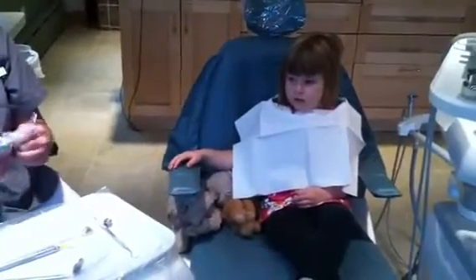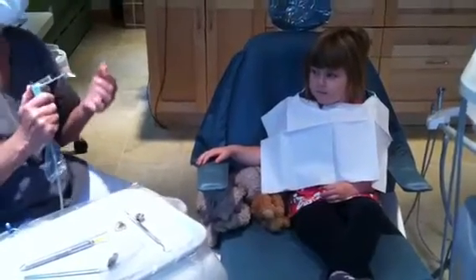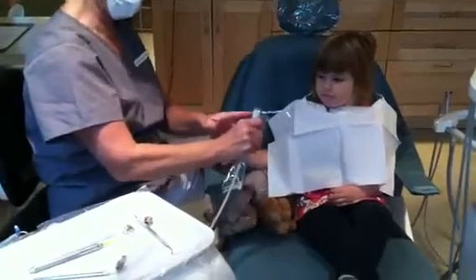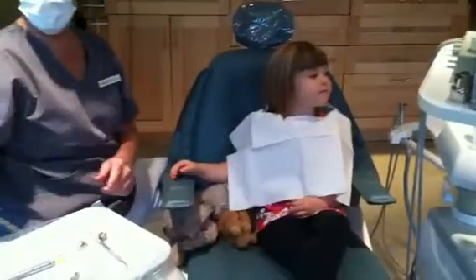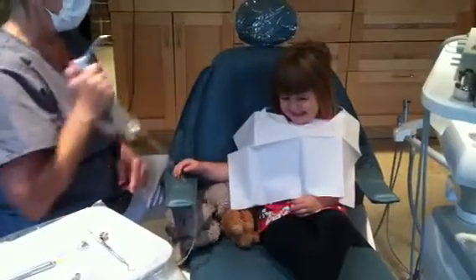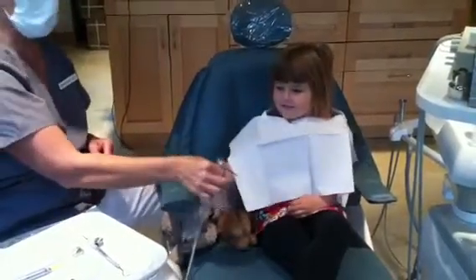This is cool. Do you have a water gun at home? This is a cool water gun because I never have to put water back in it — it always has water. See the two buttons? It always has water, it never runs out. And then this one is air. So I have air and water out of here. Want to touch it? Go ahead.